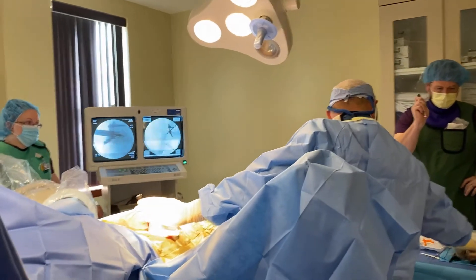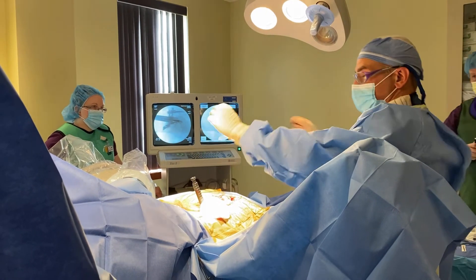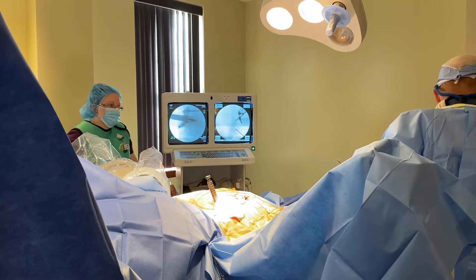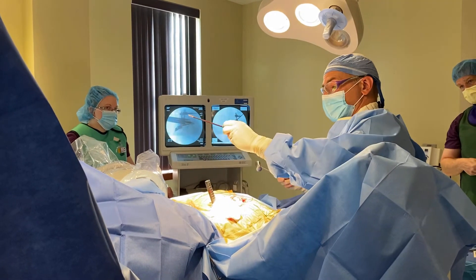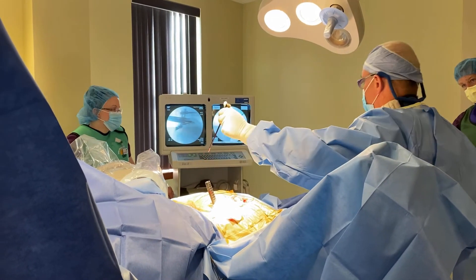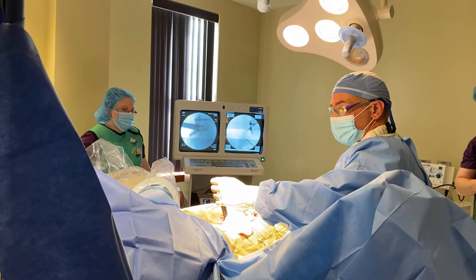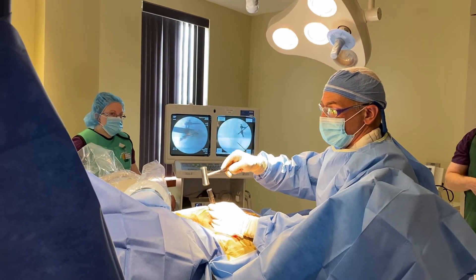We tap the material down into the cannula and put the plunger on there. We can't see a whole lot on x-ray here for the sponge, but it's set up to go. We then deploy that little sponge into the joint.